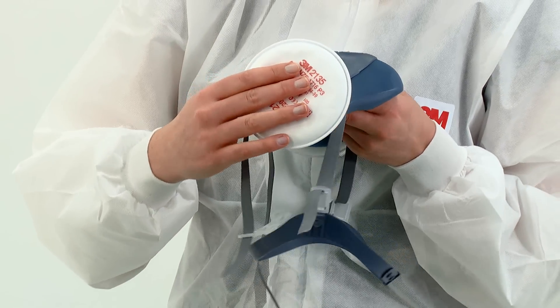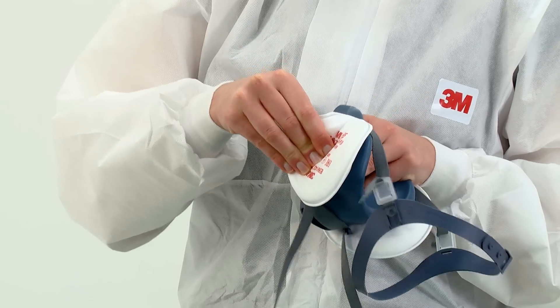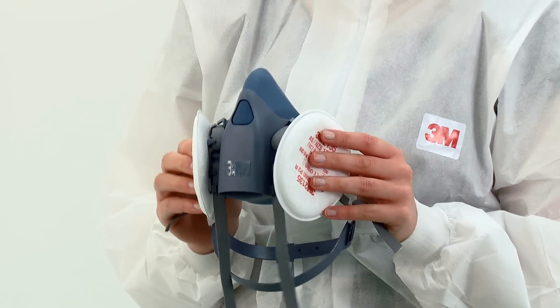2000 series particulate filters are also fitted onto the respirator with a quarter turn clockwise. Again, you should feel the filters lock into place.